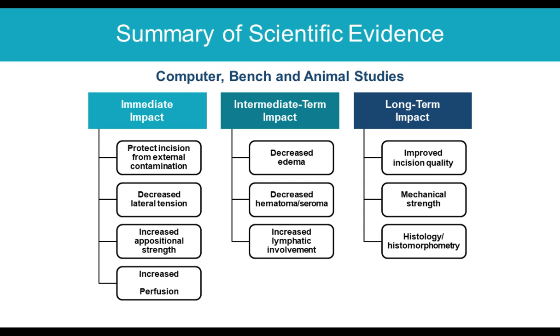So if you look back and sort of understand the summary of how negative pressure works from benchtop, laboratory, and animal testing, you can look at these as those that have an immediate impact. As soon as we push the on button in these negative pressure dressings, we're seeing decrease in lateral tension, increase in appositional strength, and increase in perfusion to the skin edges.